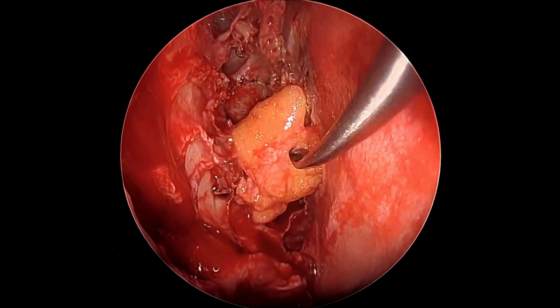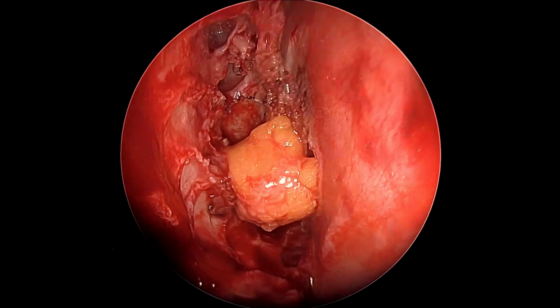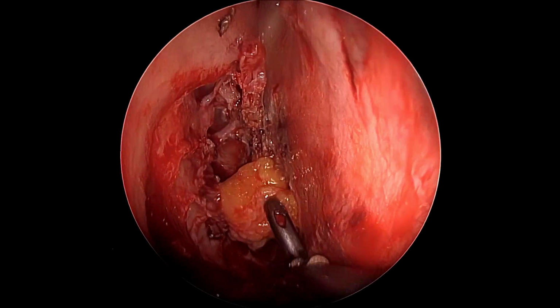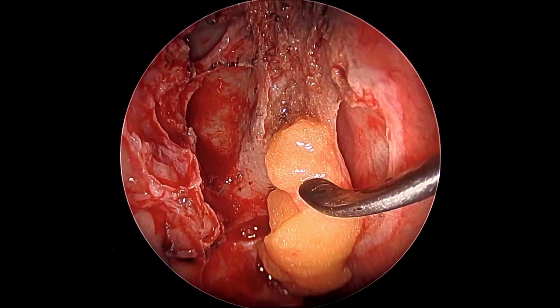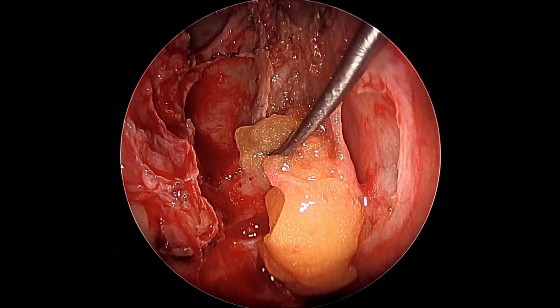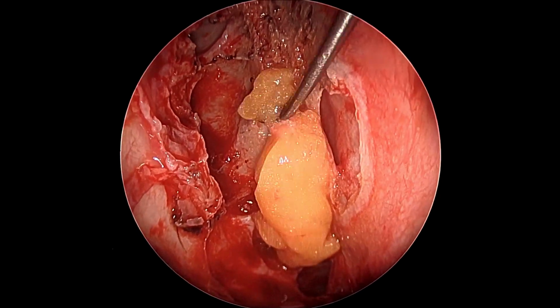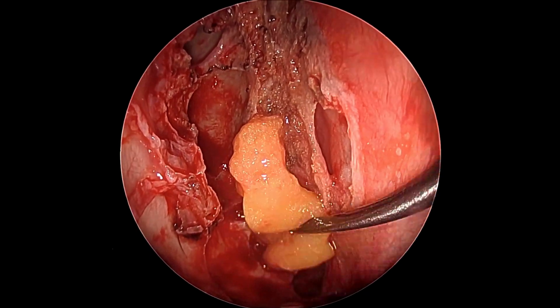We do not want to shove this fat up into the brain. That is not the goal. So it must be done gradually and progressively. Having a little larger than required fat is better than having a smaller one. The smaller fat can get lost. Larger ones, even if it's a little too large, can later be trimmed while being attached inside the defect.